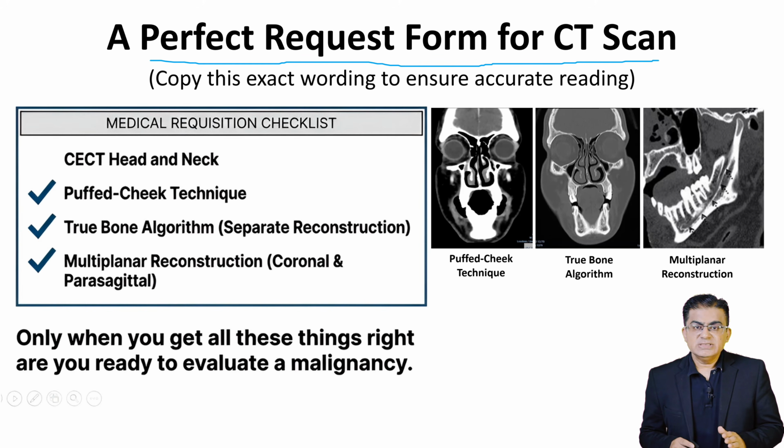Second, you must specifically mandate the puffed cheek technique. Listen to me carefully. If you do not explicitly write this on your requisition form, the technician will likely not do it. The buccal mucosa will remain opposed to the gingiva and you will miss subtle mucosal lesions.